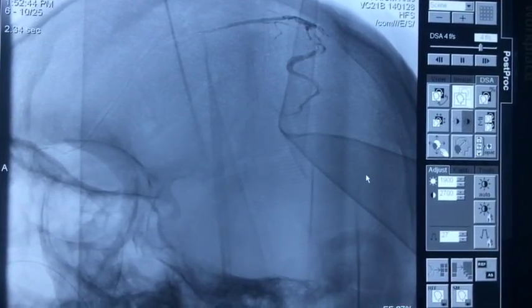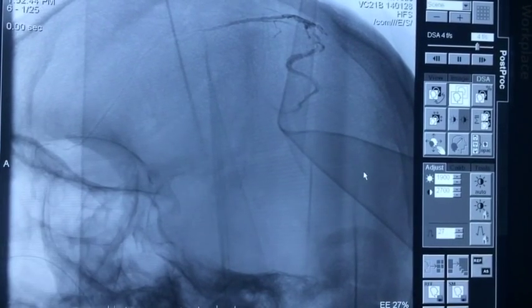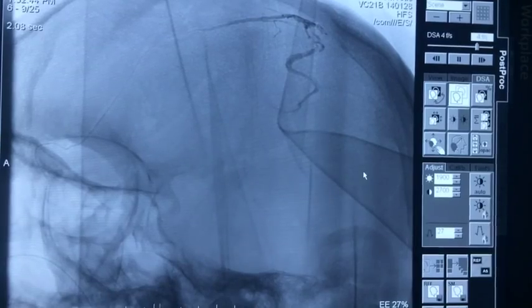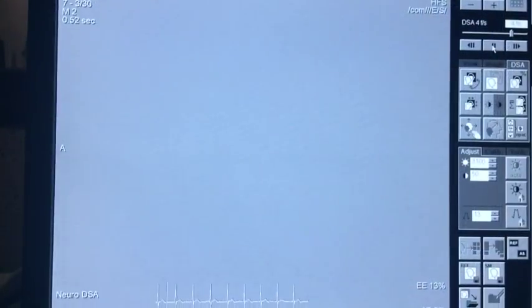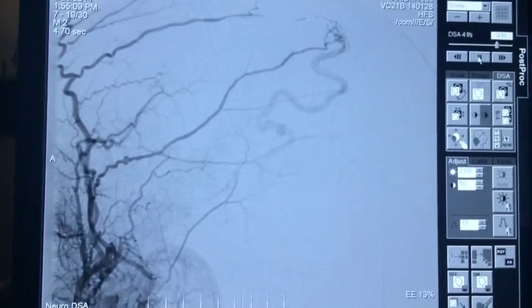You can see the progressive Onyx cast, which is looking absolutely good, right on the fistula with part of the vein and part of the artery. This is halfway through the embolization, which shows that the fistula which was filling from the superficial temporal artery is gone.